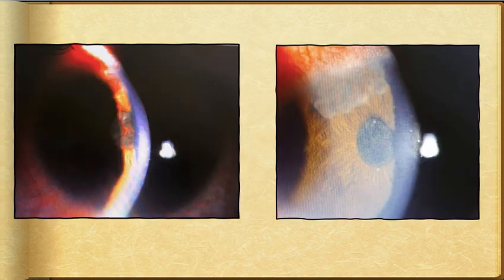Now, just to highlight about giving anti-VEGF before surgery, which is also applicable for cataract surgery, just to share the beauty of preoperative anti-VEGF contracting the big juicy vessels anteriorly. This is a case of, I think, a chronic retinal detachment case, a young patient with the only eye. So, the regression was found as early as 3 to 4 days.